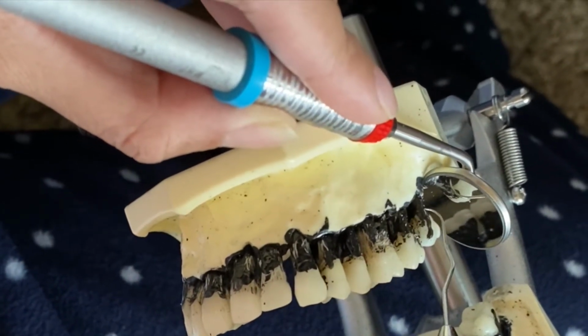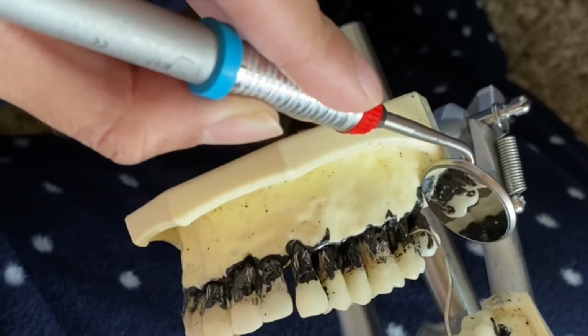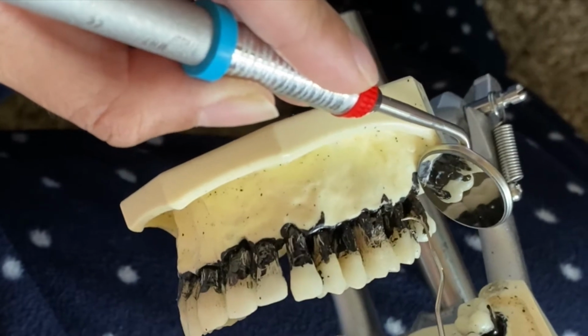It's important while you're exploring to have a light grasp and have a relaxed C-shaped fulcrum, just so you are able to easily detect calculus.